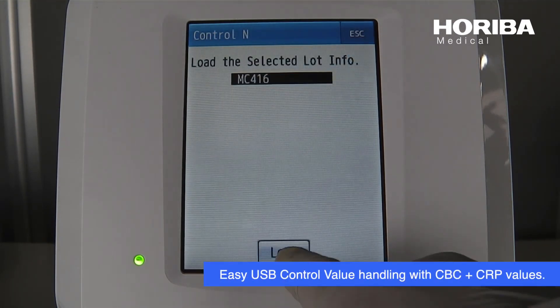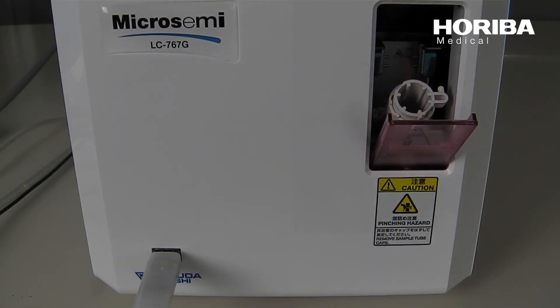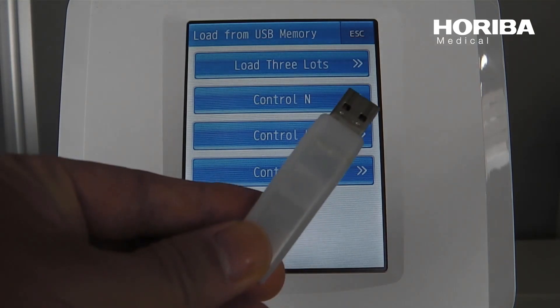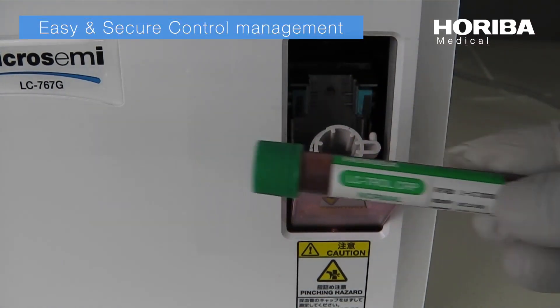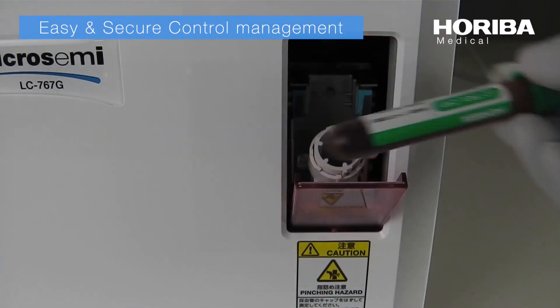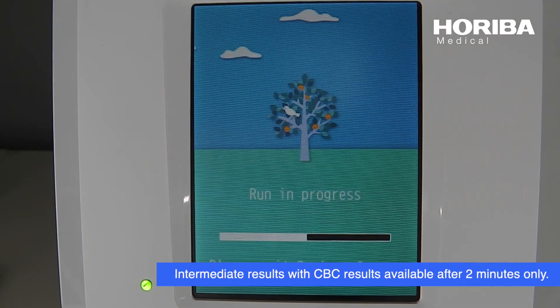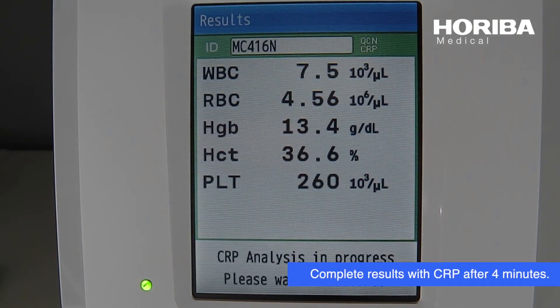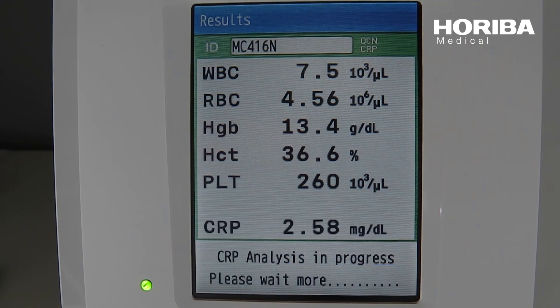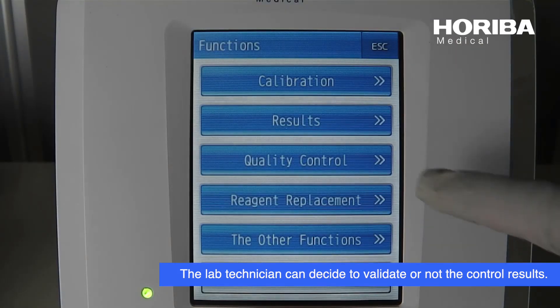Easy USB control value handling with CBC plus CRP values. Intermediate results with CBC results available after 2 minutes only. Complete results with CRP after 4 minutes. The lab technician can decide to validate or not the control results.